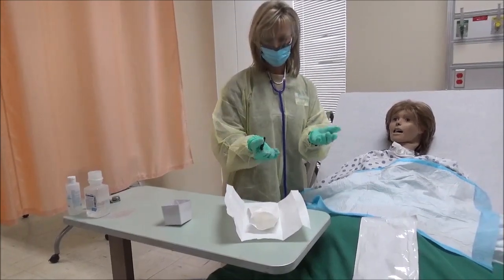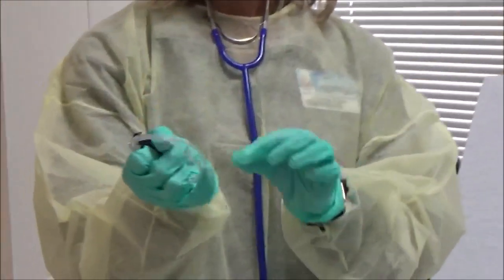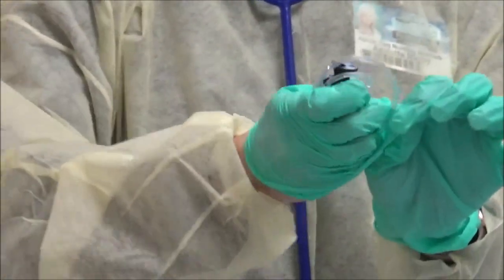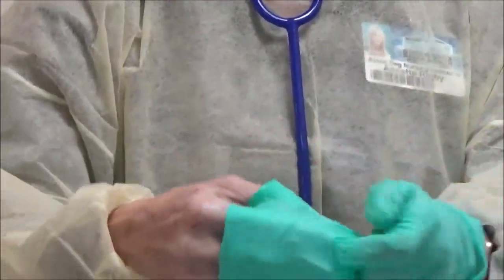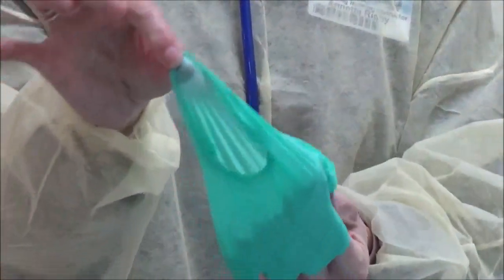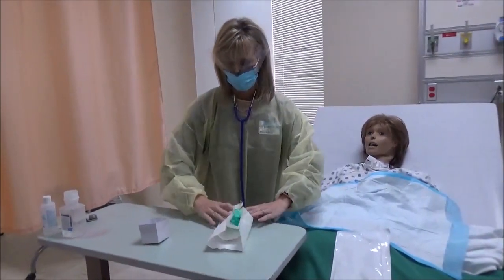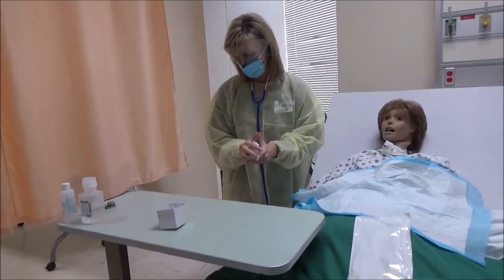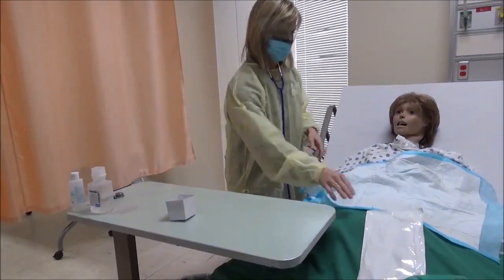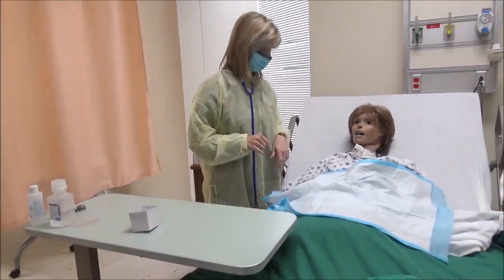And then I'm going to clean up my supplies. I want to gather up my suction catheter in one hand and keep it there. I want to take my gloves off. All that nice and neat right there in my gloves, and I can just throw all of this away. And clean up my supplies, assess my client.